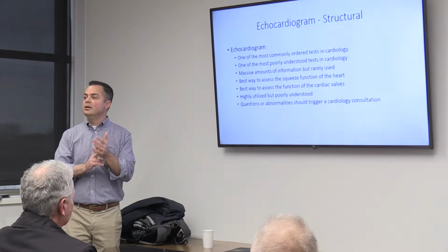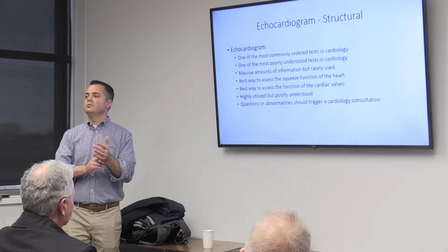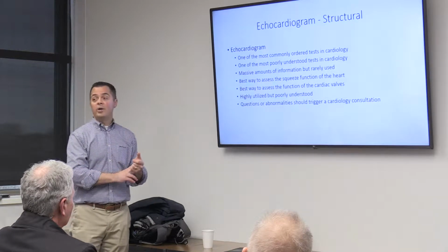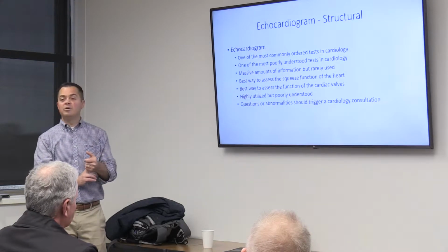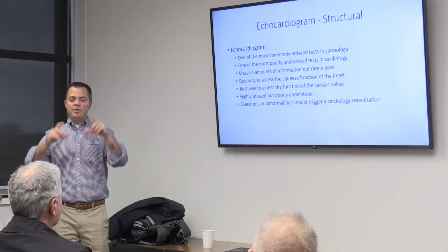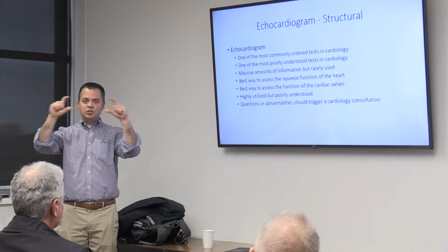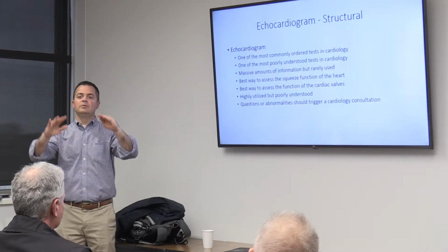It started as, you know, I can remember reading ultrasounds years ago, and we'd have like 40, 50 images with one patient. Now we have 70, 80 images with every patient. So there's a lot there. There's tons of information there. And again, if you get your report, there'll be like an impression or a highlight. What did it show? And then there'll be all this other information down below it.